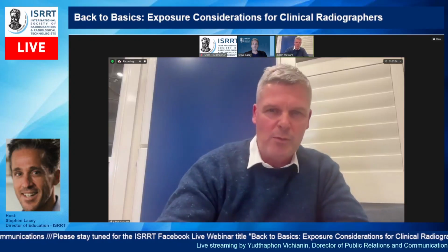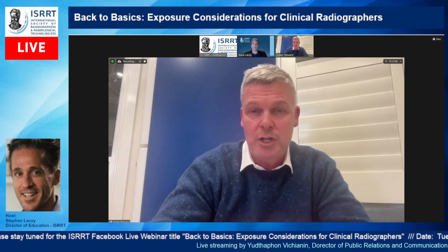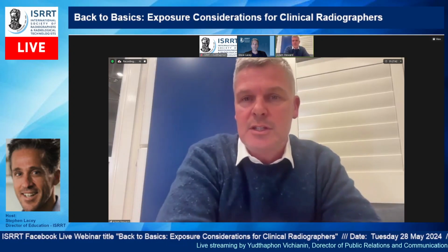It's literally an easy guide for radiographers, and a lot of vendors started putting it in because different vendors had different values for EI and so forth, and the DI gave a bit more consistency, so radiographers could learn across a bit better. So that's the deviation index. It's really just a rough measure of the dose to the detector.